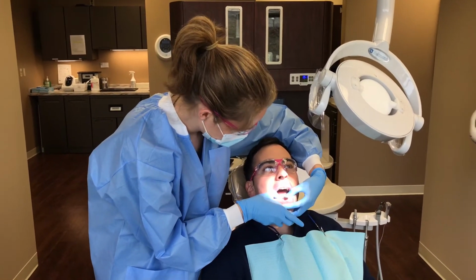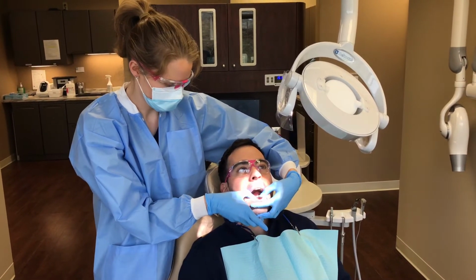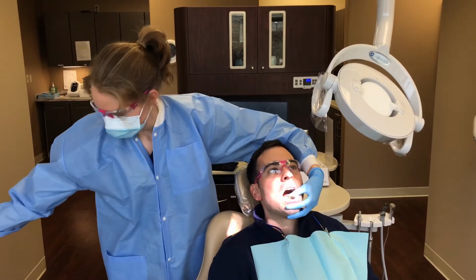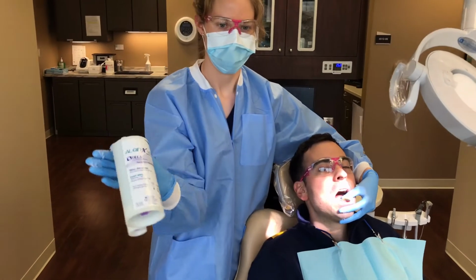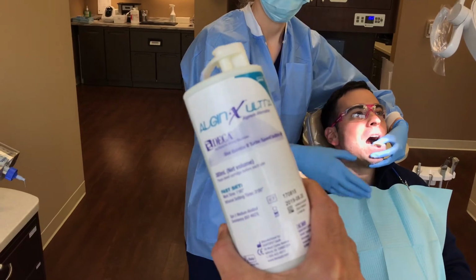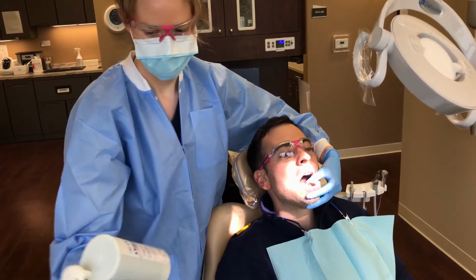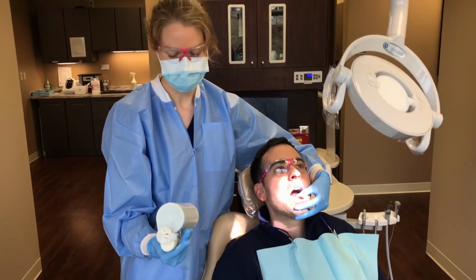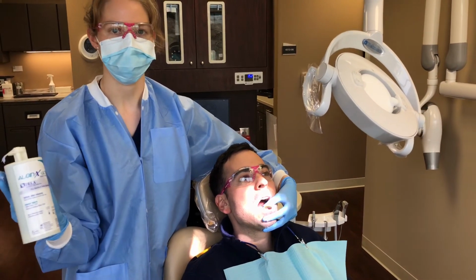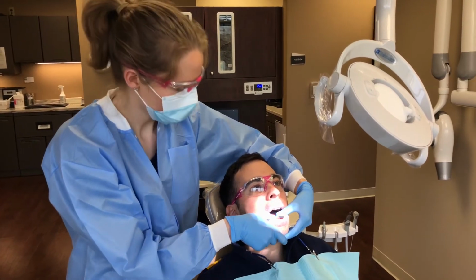And we're going to allow this material to set up, and it has a little bit longer set time than your traditional alginate because it's a PVS based material. If you ever forget the setting time, you can always double check the cartridge right here. And so it has a working time of 1 minute, which is somewhat similar to alginate, a little bit slower, but an intraoral setting time of only 3 minutes. So you're not going to be in for the full 5 minutes that you would be with a traditional PVS material.